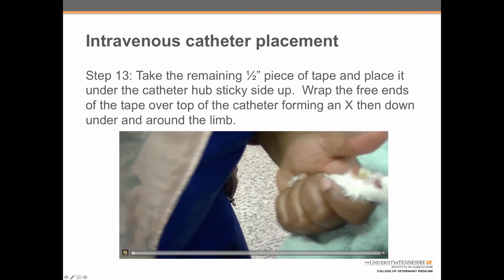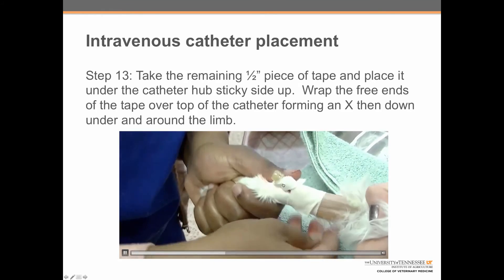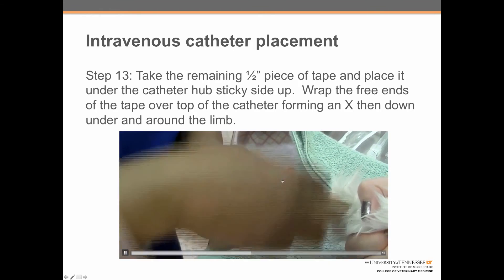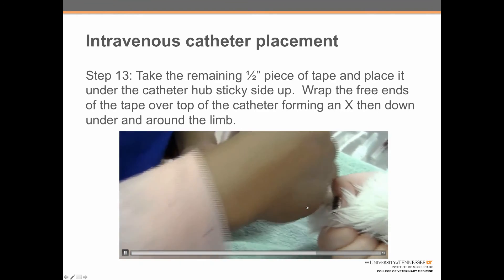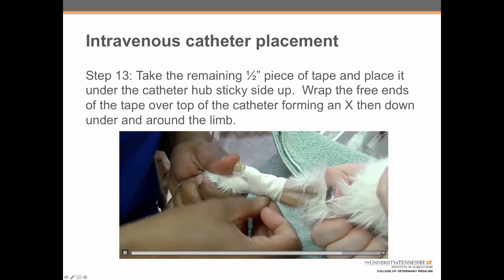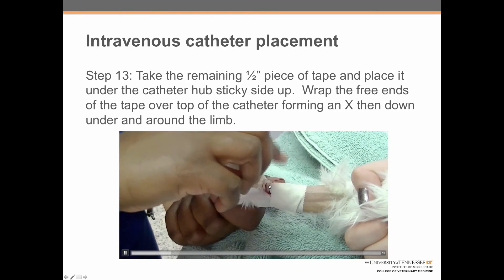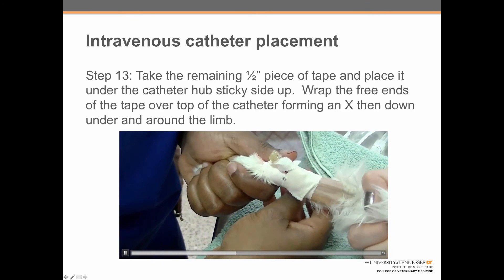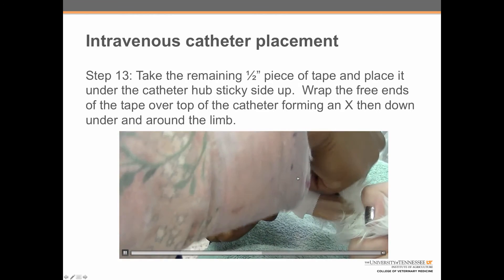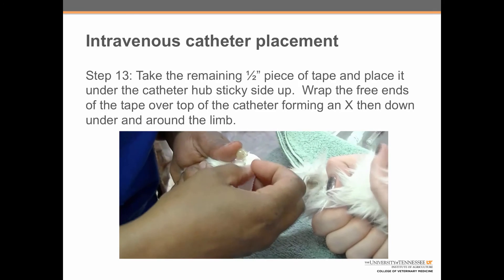Step 13: take the remaining half-inch wide piece of tape and place it under the hub sticky side up, then wrap the free ends over the top in an X pattern, and then down and under around the limb. This step secures the injection port. The tape goes under the port sticky side up, then crosses around onto the injection port — first one side, then the other — forming an X to make sure the hub doesn't move.